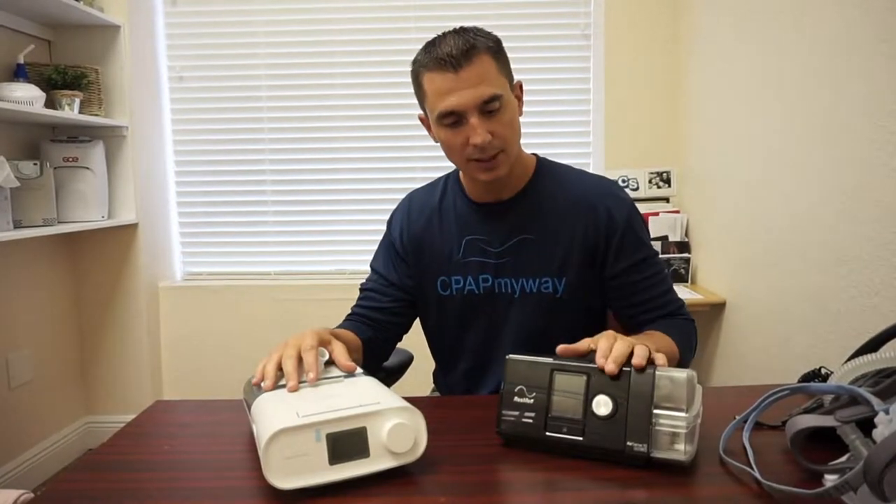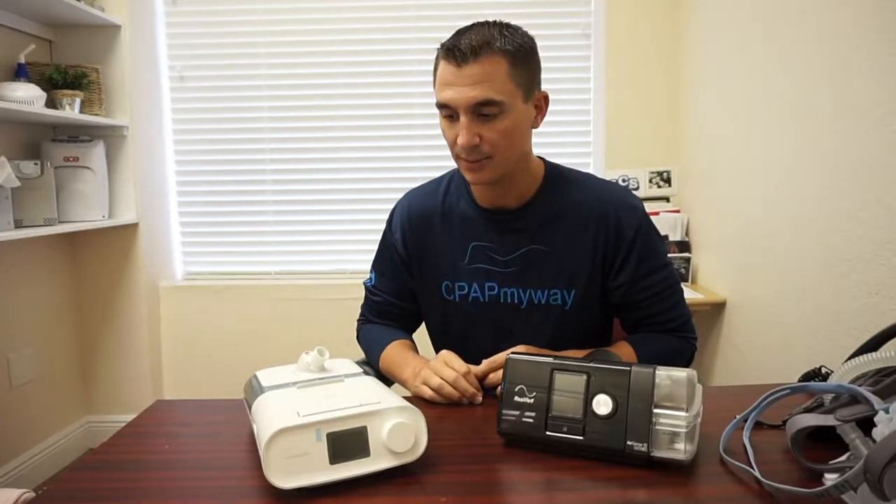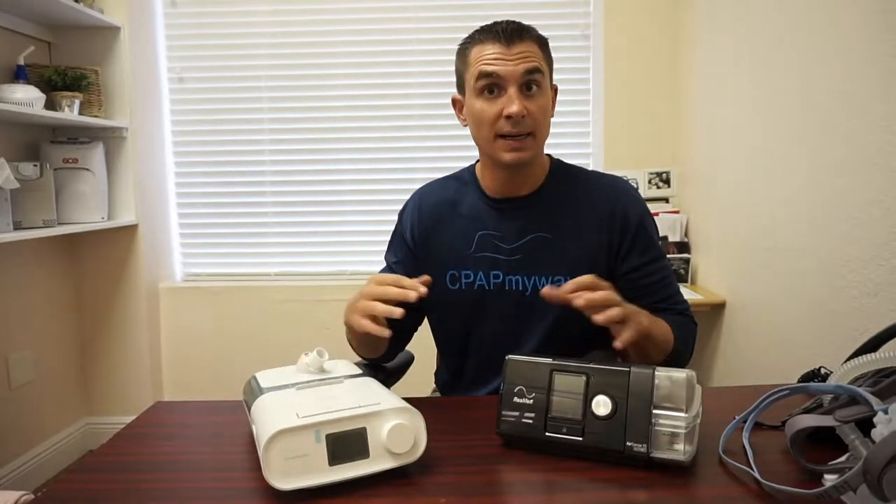We'll start off on the machines themselves. These are two of our most popular: the ResMed AirSense 10 and the DreamStation CPAP. This is obviously just two of the many that are out there, but they're all basically the same concept. They're going to have filters, they're going to have a humidifier, and this should give you an idea of what yours potentially needs to be maintained. I may not show you exactly where the filter is, but it's there somewhere.